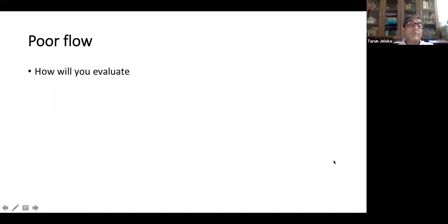Poor flow, how will you evaluate poor flow? So if somebody has fluid overload or edema, how will you evaluate? It depends upon when in peritoneal dialysis you are seeing this. If you are seeing this at the initial start of peritoneal dialysis, then there might be many reasons.